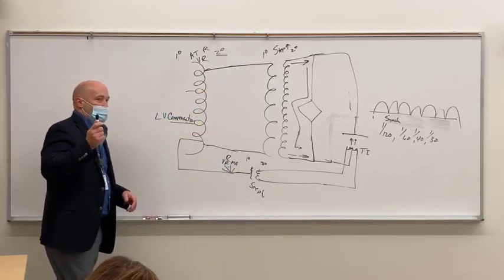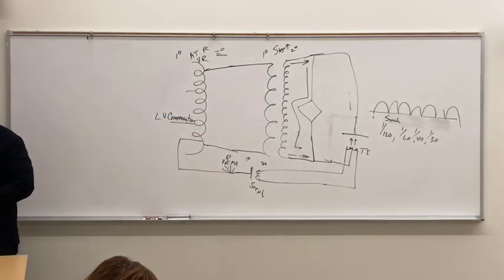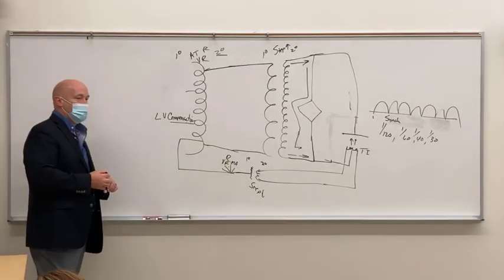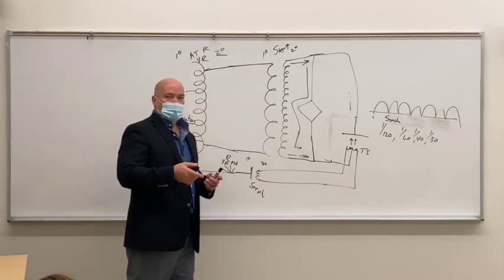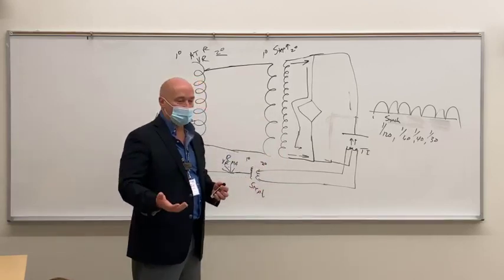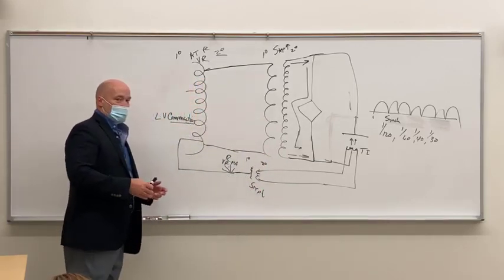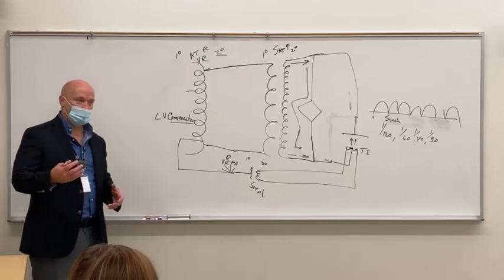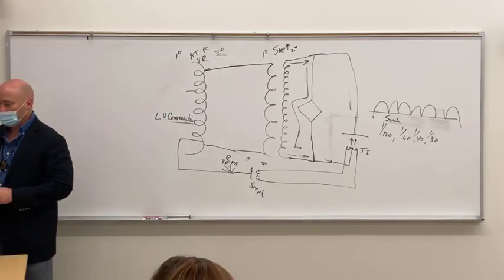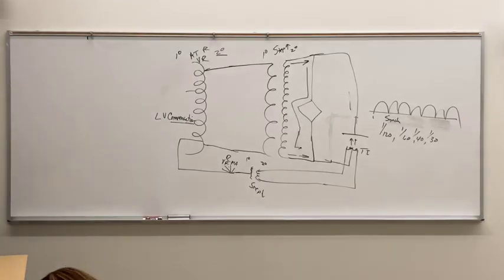So shortest exposure time, most accurate, and that's what you're going to be using. We talked about what a mAs timer was, and where did we say you see a mAs timer? Portables. It's on a machine that is limited and it typically only has a single mA station. And so what you're actually doing when you adjust your mAs is you're adjusting your time. So mAs timers are really just timers that you adjust the mAs by adjusting your timer.